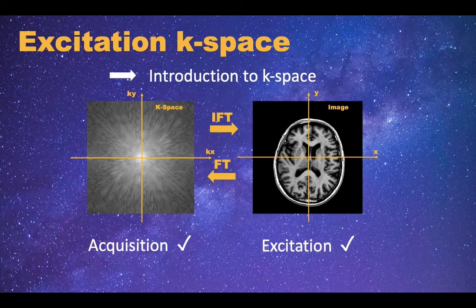Note that theoretically we can also use 1Tx to control the excitation K-space, but that usually leads to extremely long RF pulses that suffer from severe T2 decay. With multiple transmit channels, pTx can cover the K-space more efficiently. Therefore, it's pTx that made this application available for real problems.